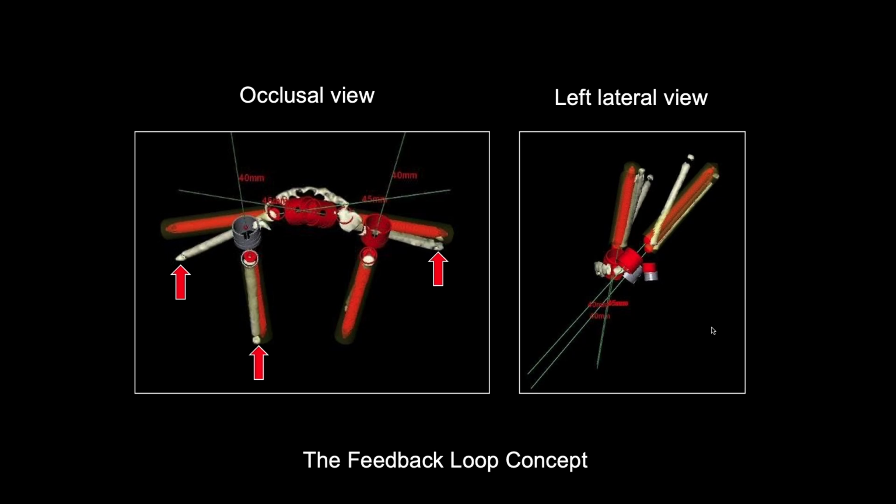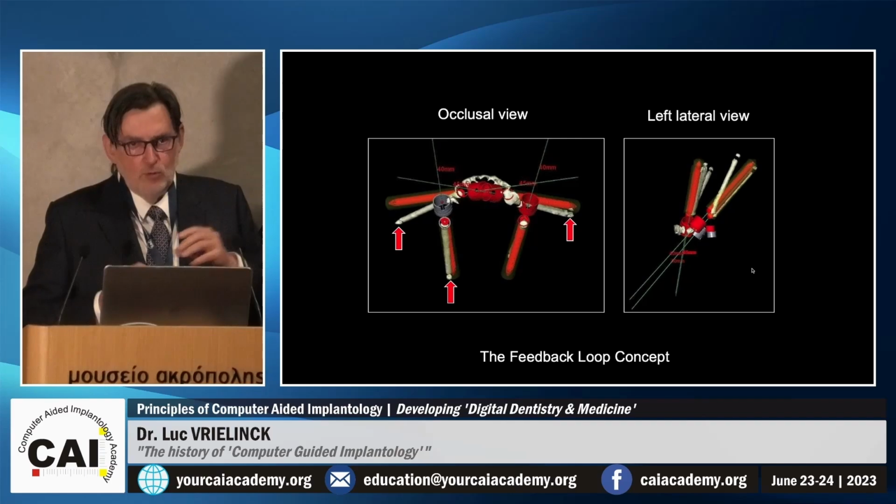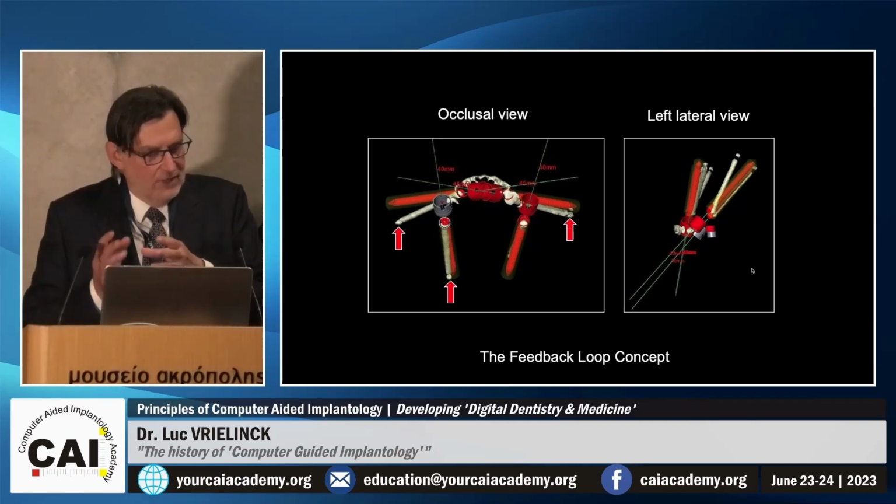So this put us back. I was flying high, but it put me back with my feet on the ground. Okay, this will not work. We didn't do drill guides for zygomatic implants anymore. But what is the lesson? I showed you a zygomatic case, but I could show you a standard or whatever case.